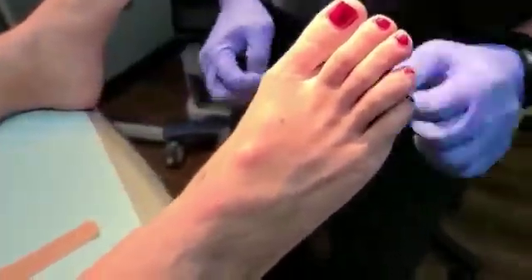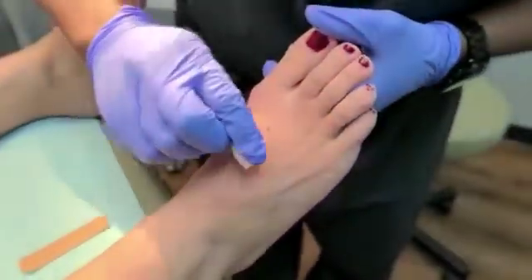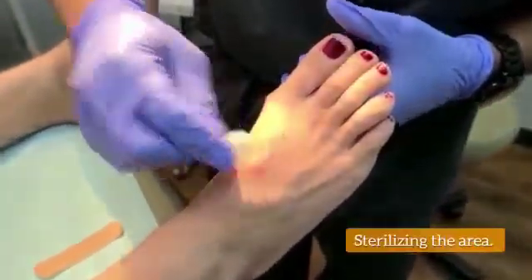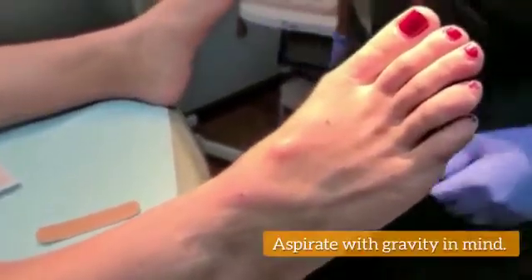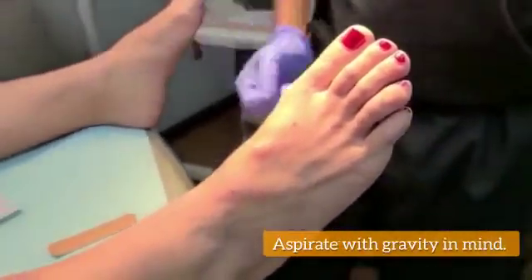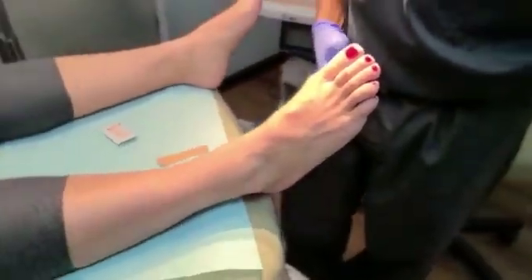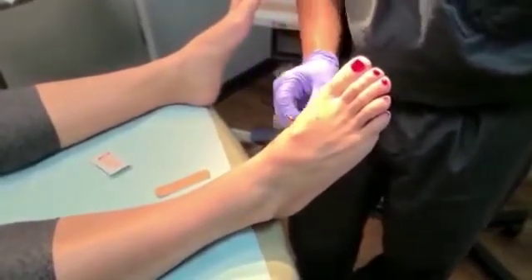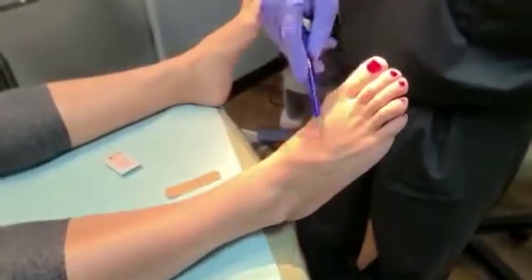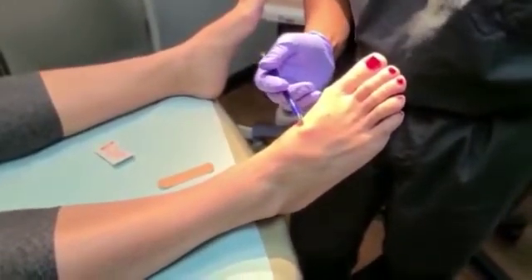Now that our patient is good and numb, we are going to aspirate or drain it. The important thing about aspirating or draining this cyst is that we want to do it in a position similar to gravity. Her foot, the way she's sitting right here, gravity is pulling things down towards her ankle. When she's standing or walking or doing normal activity, the foot's going to be down on the ground, so gravity is pulling it down towards the inside of her arch or towards the side of her toes or in between her toes. So in this case, I'm going to be going from this direction to aspirate.